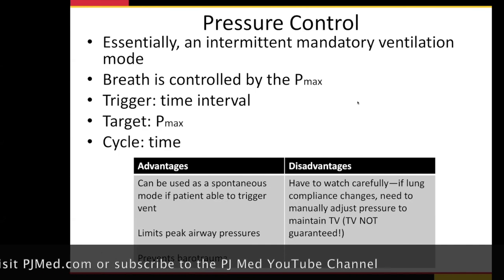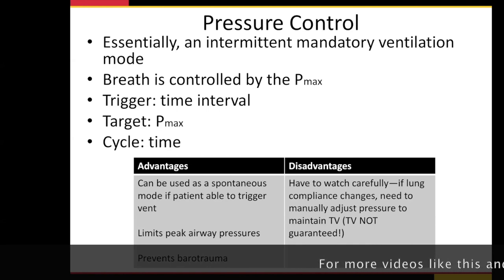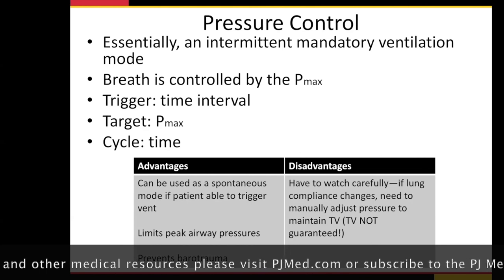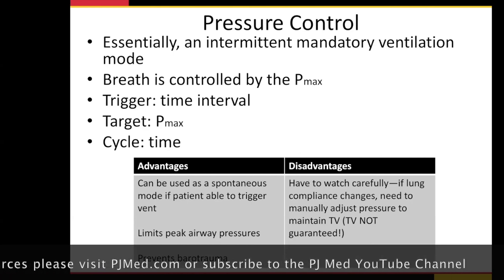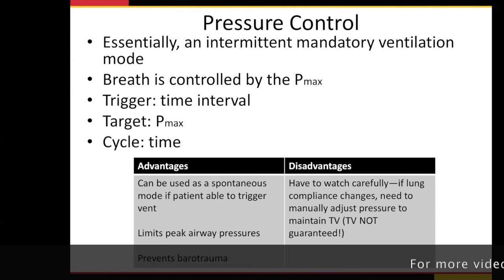And so that's why you have to be careful if you're using this, a little more advanced mode. I wouldn't recommend this right off the bat unless you're getting some hands-on training with it. Because the problem is, if their lung gets better and you dial the wrong pressure in, you can cause damage to their lung because you're putting way too much pressure in. This is a mode where we want to be really careful about a concept called plateau pressure, which I'll get to, okay? So we use this, but you have to make sure the patient's sedated and you have to be watching them carefully.